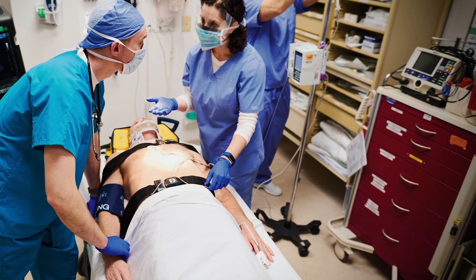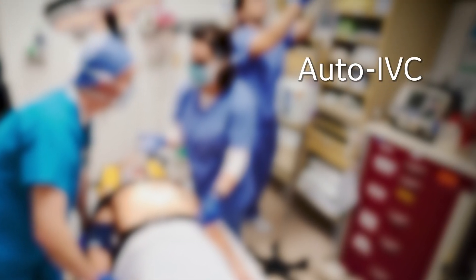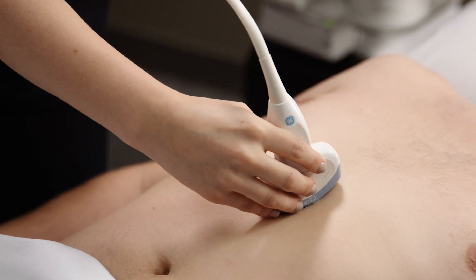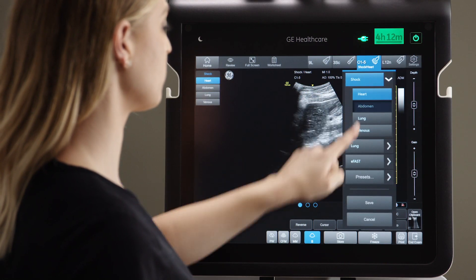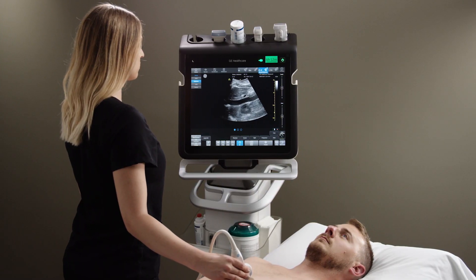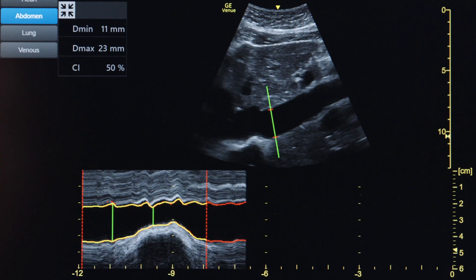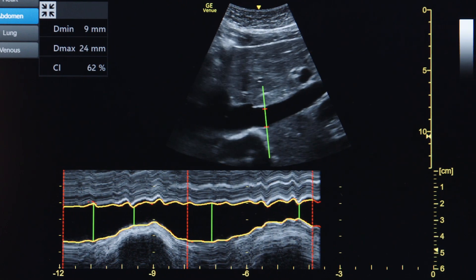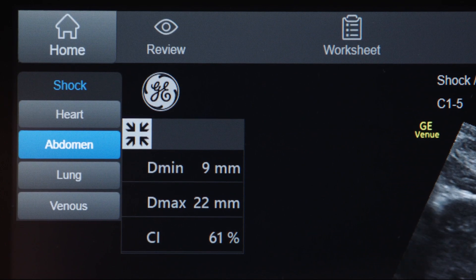You may want to assess the respiratory variability of the IVC. The Collapsibility Index is a useful tool to evaluate the IVC, but taking all the measurements to perform and calculate the Collapsibility Index can take too much time. If you obtain the IVC view, Venue calculates the Collapsibility Index for you.